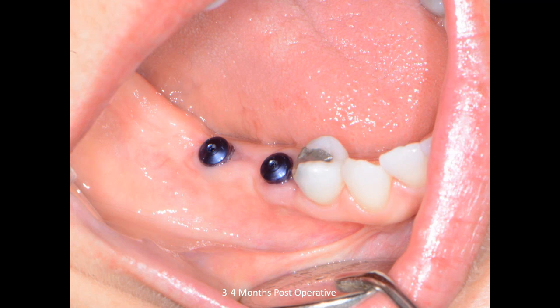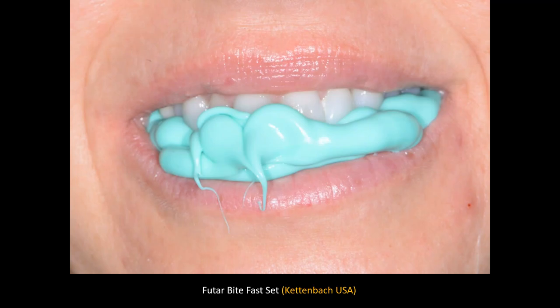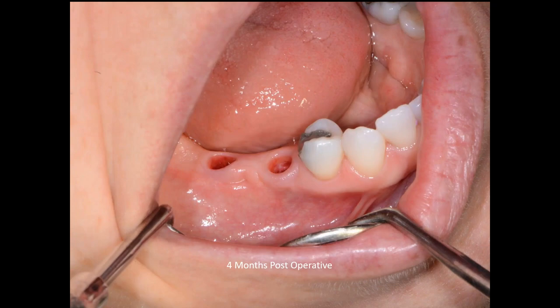3 to 4 months postoperatively, the tissue has adapted nicely. We'll take a radiograph to ensure that everything looks great. We'll take a bite before we remove the healing caps and an opposing arch. And then at this point, we'll remove the healing caps and test the implants objectively with some type of resonance frequency device. So I already illustrated one device.